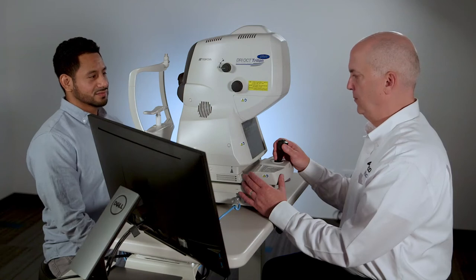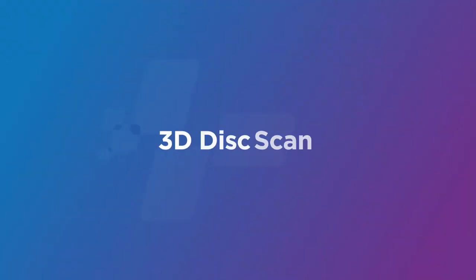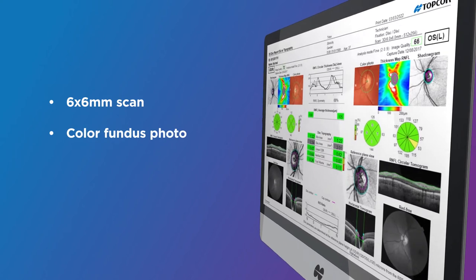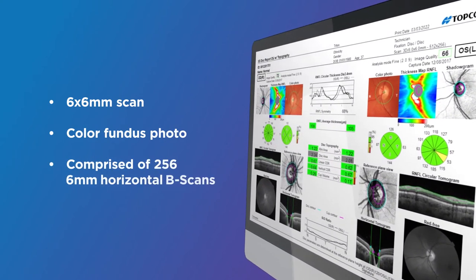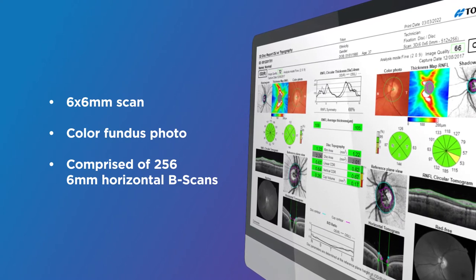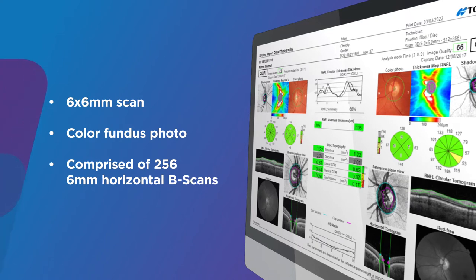Once the scan is selected, the Triton will instantly go into capture mode. The 3D disc scan is a very fast, high density, 6 by 6 millimeter scan and color fundus photo of the optic nerve, comprised of 256 6-millimeter horizontal B-scan sections. The 3D disc scan is a classic glaucoma scan complemented by a high magnification color optic nerve photograph.